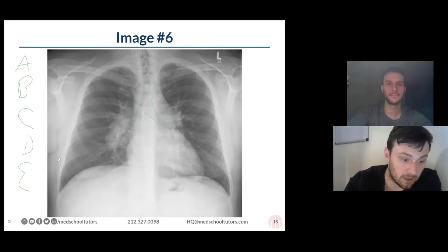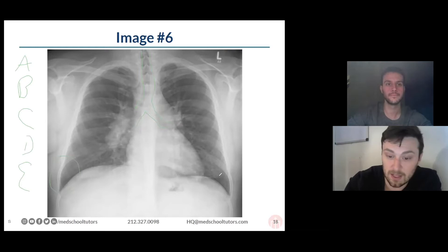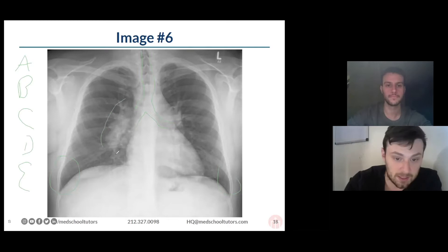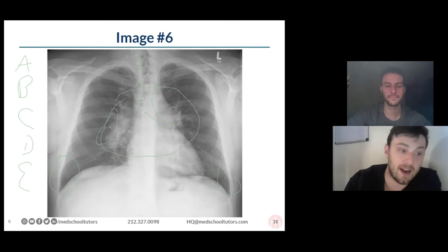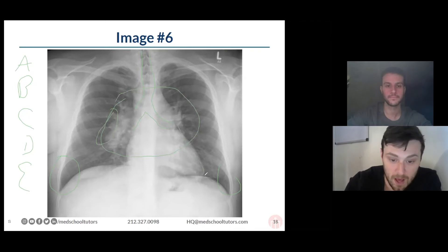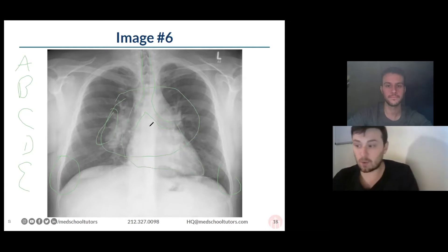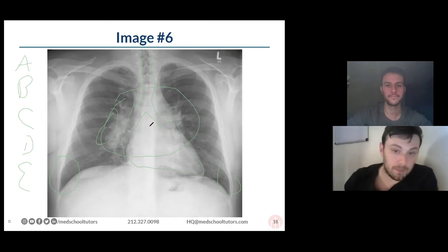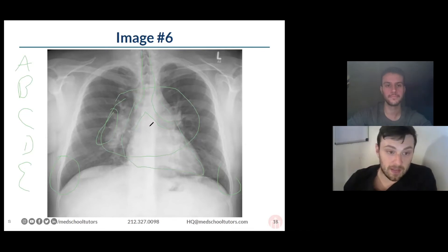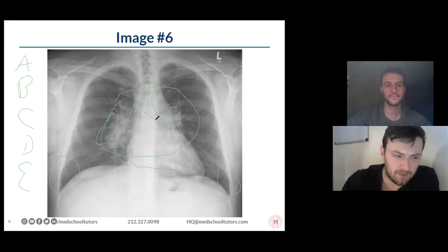Basically, B means take a look at the general lungs — look at your costophrenic angles, they look fine. C stands for cardiac, so you do your cardiac silhouette — that looks normal, less than one half the diameter of the chest. There's a question about how to differentiate AP and PA: if they wanted you to know, they will give you the letters on there. It's not usually relevant on Step 1.